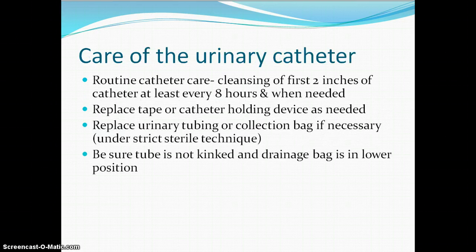Care of the urinary catheter then, our routine cares can be delegated to a nursing assistant as part of their cares, but we as nurses would always want to look at that catheter to make sure that it's intact, that it's not rubbing or causing trouble for that perineal area. We always want to cleanse from the perineum out.